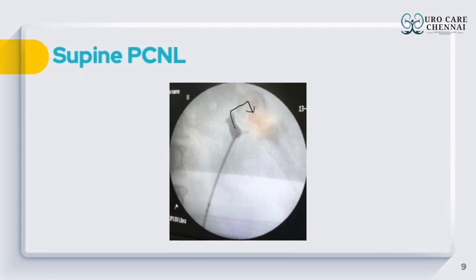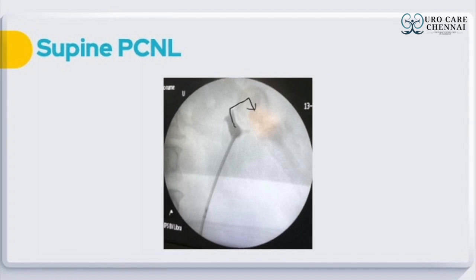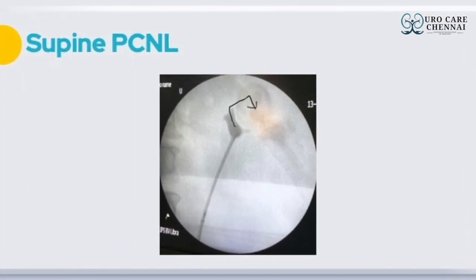We can see the angulation here in this image. So supine PCNL was done to clear off the stone. So ECIRS came very handy in this situation.